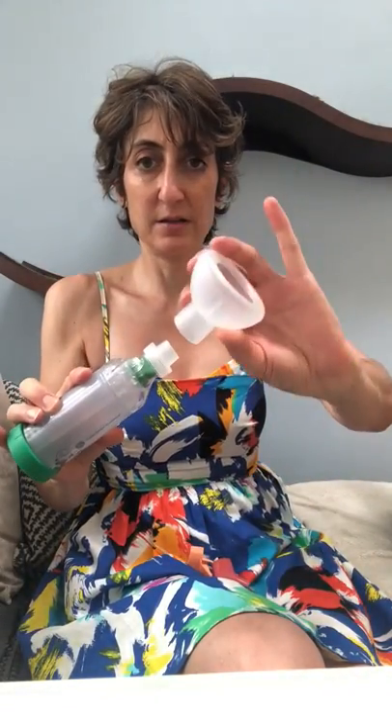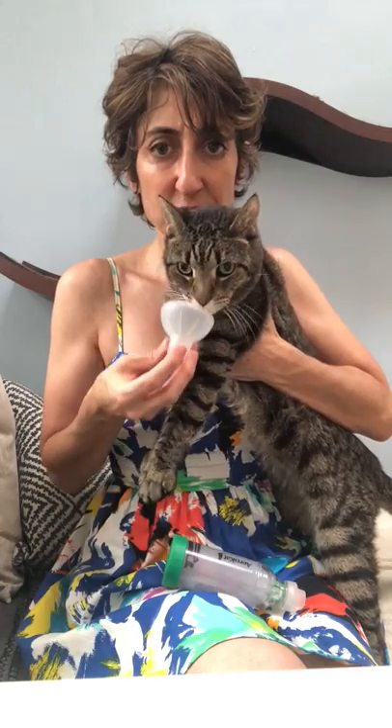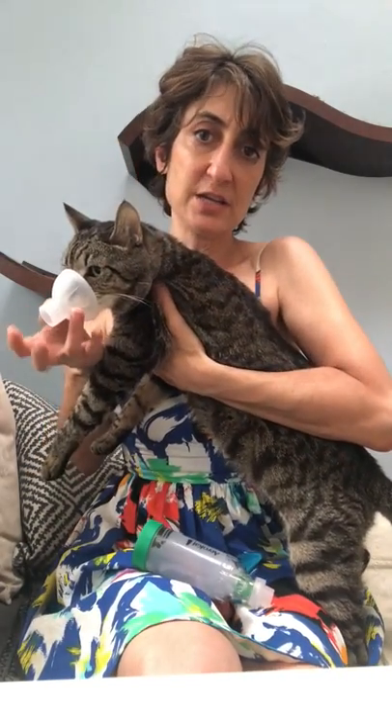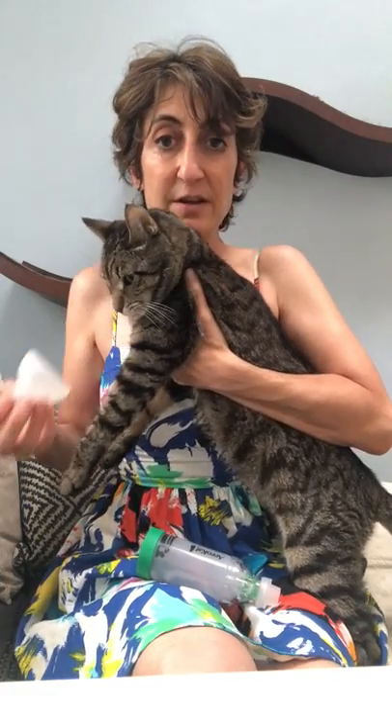So when you get the inhaler, it's going to come in pieces. You have to find the top that works for your cat. You want it to fit over their muzzle loosely — I'm not pushing it, I'm just kind of gently holding it. It's good to get your kitty just kind of used to you doing this for short periods of time. Every cat's a little different; some people have to restrain their cats a little bit more. Kippy's pretty tolerant.